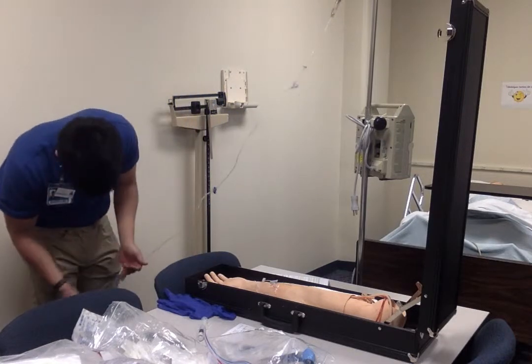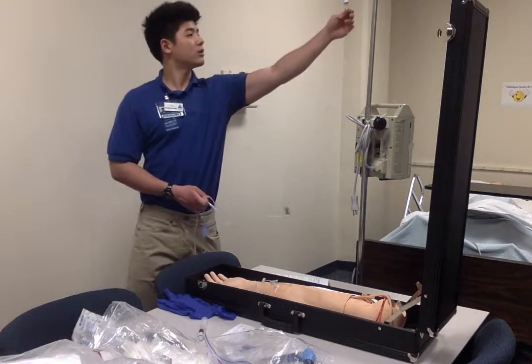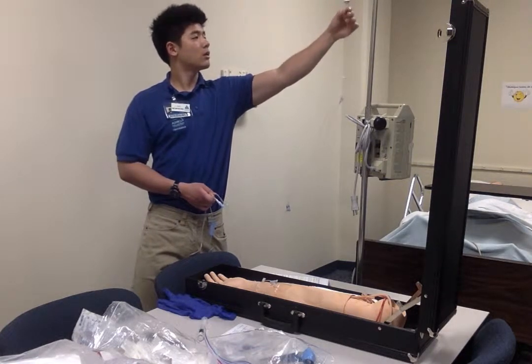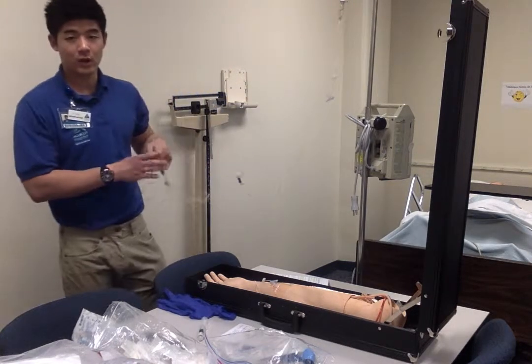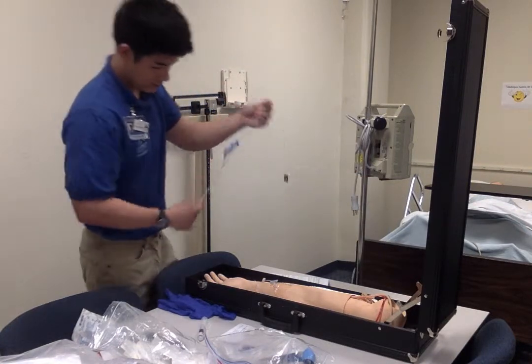Okay, so it's primed. Should be in there. And then of course I'll be once again labeling them. And I'll set this aside.